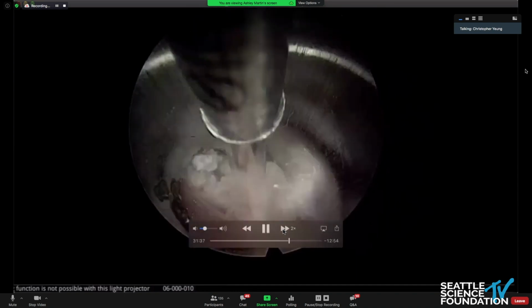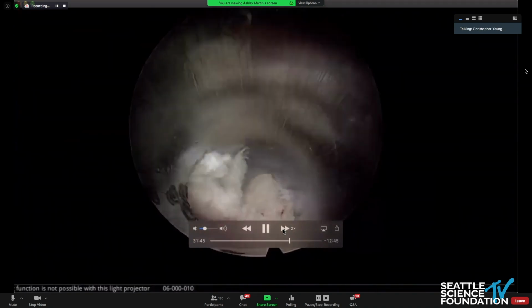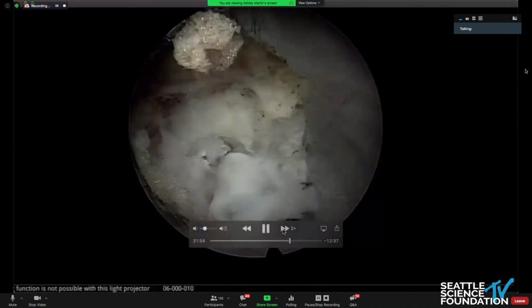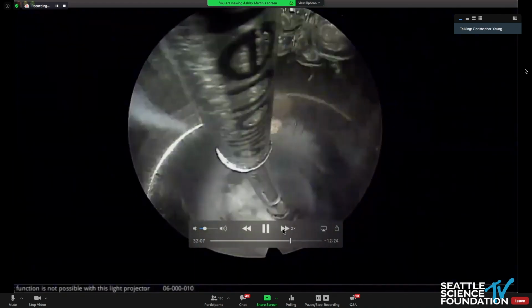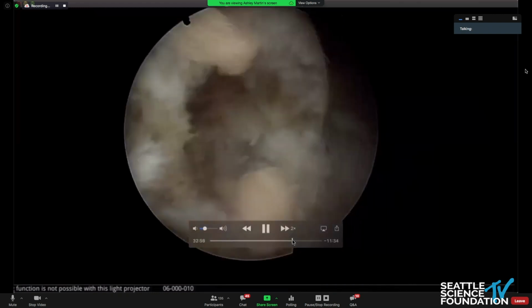You'll see that I dissect and find some more patulous annulus and some of the herniation. And then also start removing more of the undersurface of the superior articular facet, which was actually causing some foraminal stenosis. So let me just fast forward even faster.